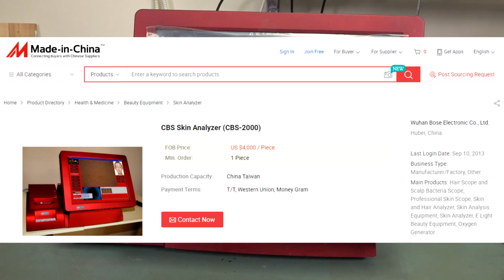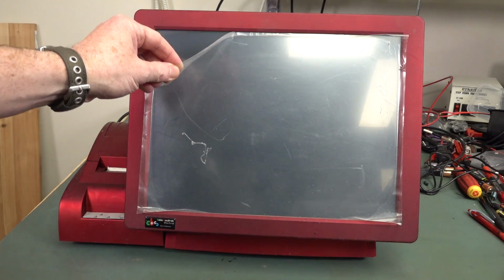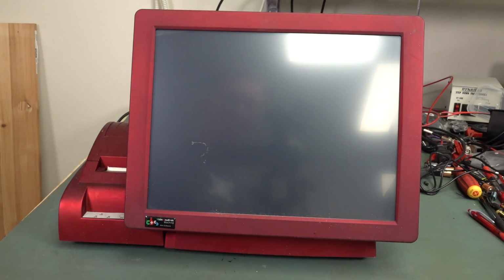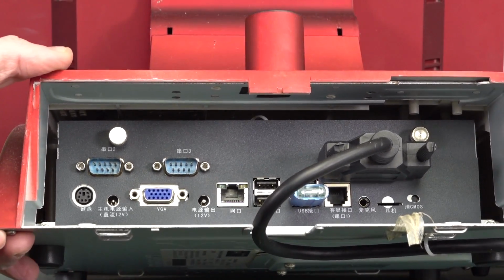But this is apparently some skin analysis machine running some custom software. So it's really interesting how you can actually get custom bits of kit like this tailored to a specific industry. And look, it even has the protective film still on it. So I'm going to take that off. Ripper.